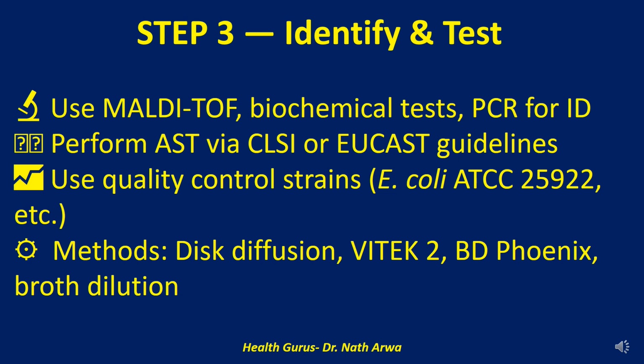Every lab knows. If you're not running quality control, you're just guessing. Be sure to include reference strains like Escherichia coli ATCC25922, Pseudomonas aeruginosa ATCC27853, or Staphylococcus aureus ATCC29213.